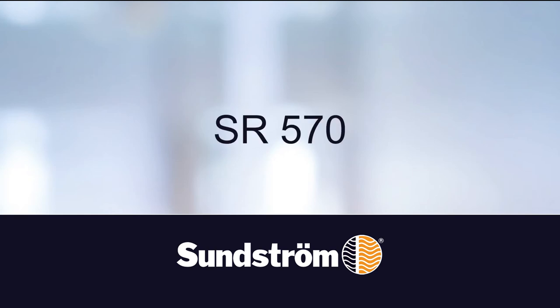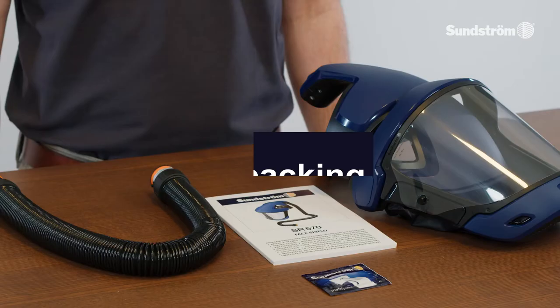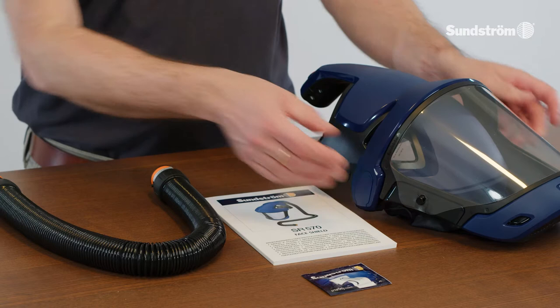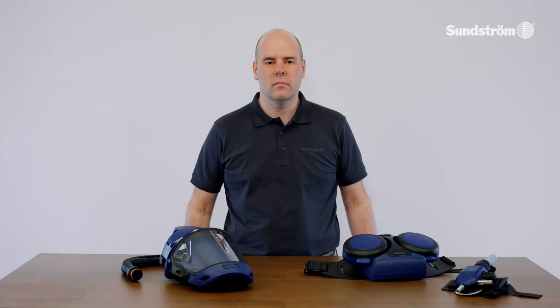SR570. Unpacking. Check that the packaging contains: face shield, peel-off with clips, breathing hose, user instruction, and cleaning tissue. Connect the hose.